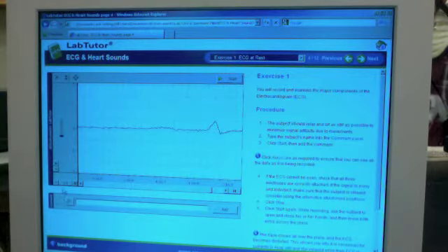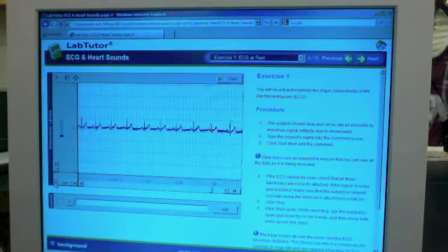On the other hand, I may want to look at something like how many times is the heartbeat per minute, and you can see that would be kind of hard to see at this particular scale. So I can also scrunch things up some. Oops, I'm going the wrong way. Like so. All right, and here I can see that I have, in fact, about 10 seconds worth of data, right? And I can see that in this particular time, looks like the heart beat about 8 or 9 times. So that's going to help me look at things that are longer term.